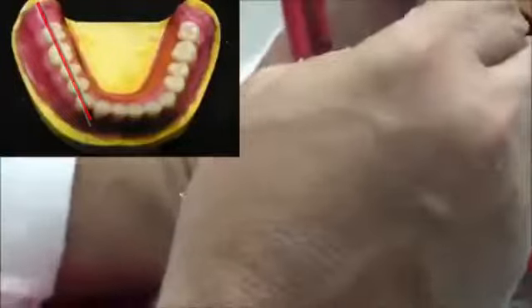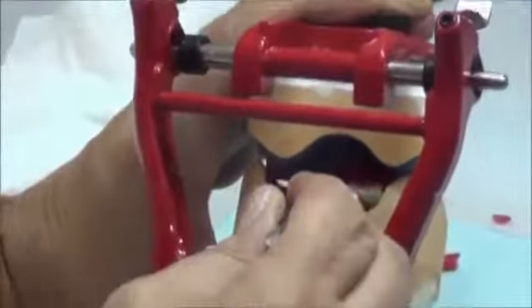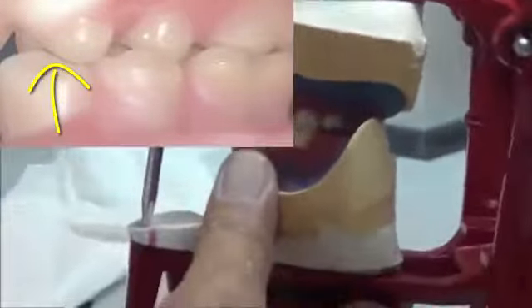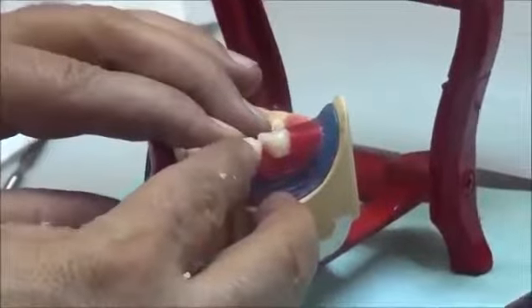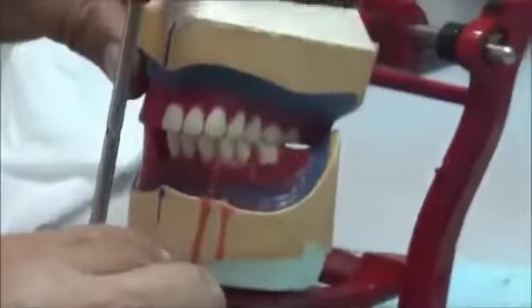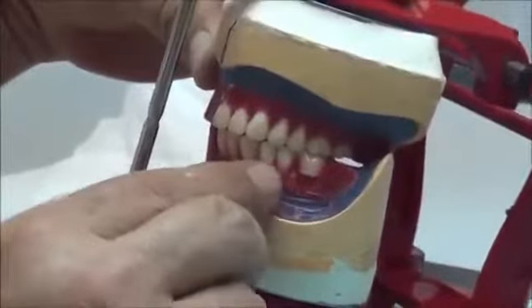On the lingual side, this depends on the morphology of your tooth set. Some teeth sets come with lower 4 without any cusp. You remember that in tooth number 4 in natural dentition, the lingual cusp is underdeveloped. It's not like the lower 5. So if it's underdeveloped and you get the set where the first premolar is closer to the canine, we don't do lingual adjustment. But if the morphology of your set of teeth has a lingual cusp, we interdigitate it with the upper as we did with the second premolar.